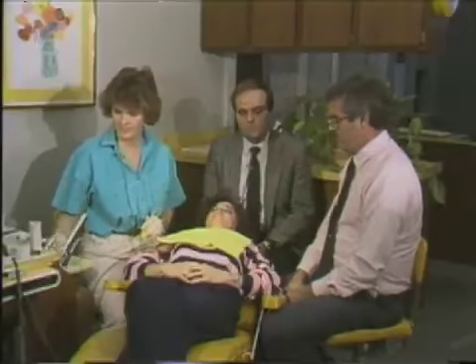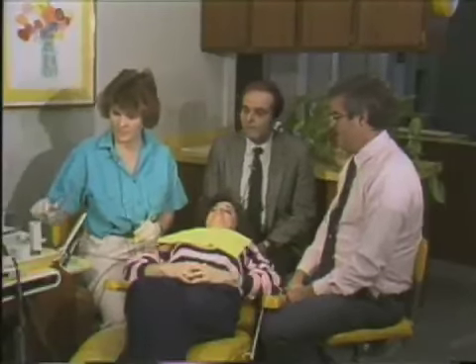Okay. Now we're going to ask one of my dental hygienists to assist us in this procedure, just like she normally would do in the practice. The first step is, of course, the preparation of the teeth with pumice. Paul, you want to comment on the importance of this and what the particular procedures are?